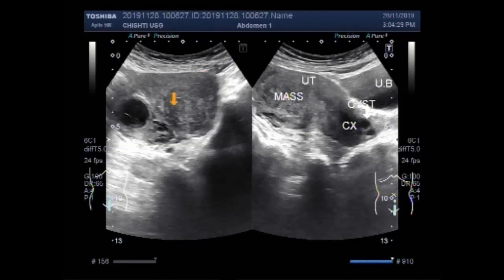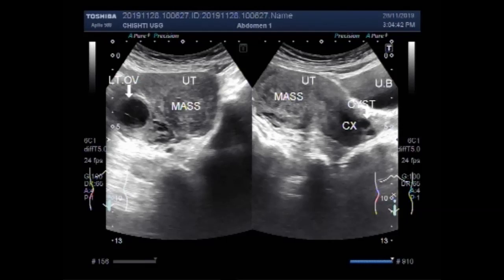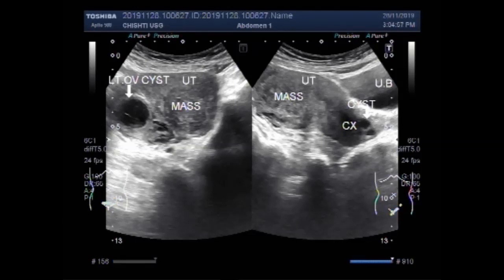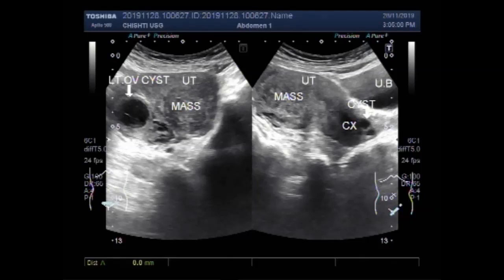This one is the mass in the uterus — fibroid — and this is the left ovary and cyst. This is the mass in the uterus — fibroid. The mass measures about 27.8 mm x 27.5 mm, and the mass measures about 31.2 mm x 37.0 mm.